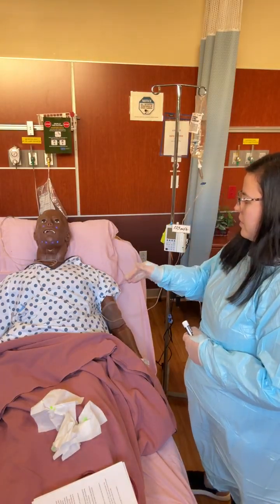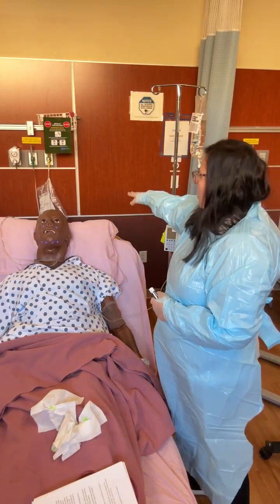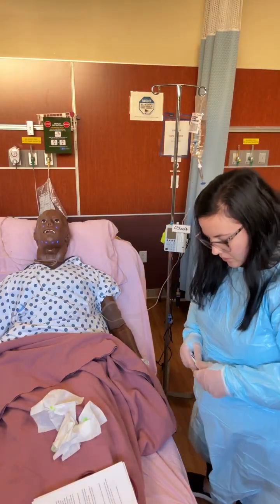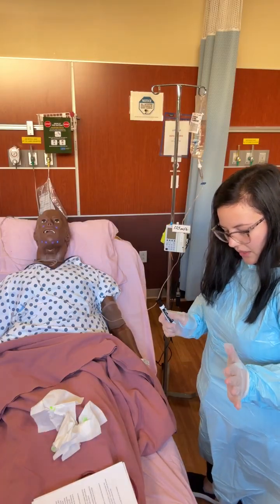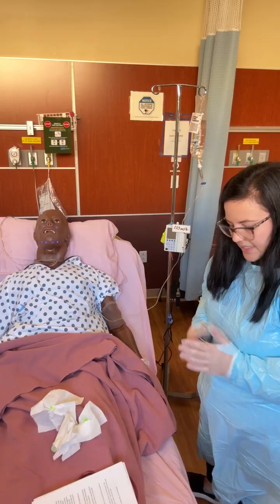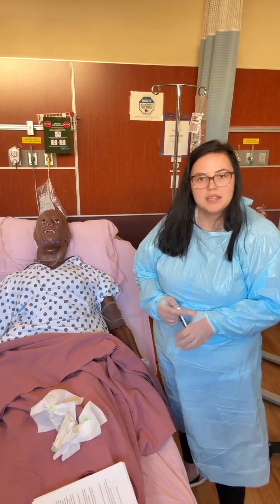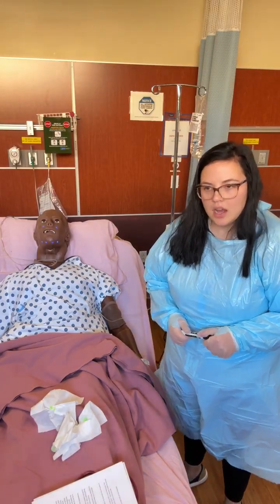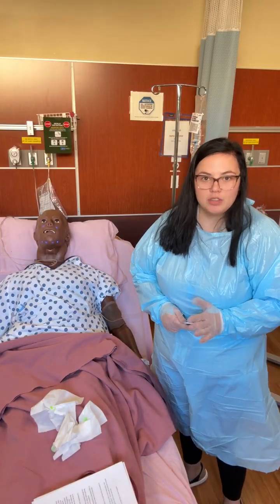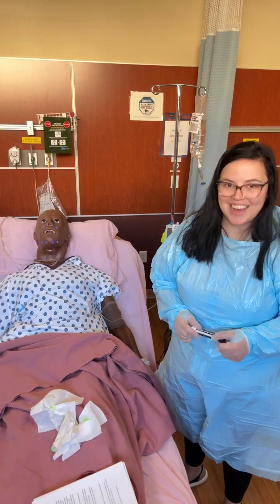Just be mindful the simulator is typically plugged into the wall, so make sure that you're not pulling any of those cords out from the wall. Always wear gloves when you're touching the simulator, and please say sim question if you need assistance from the sim staff or from your instructor. The famous sim question is, do you actually want me to do this? And the famous sim answer is yes.